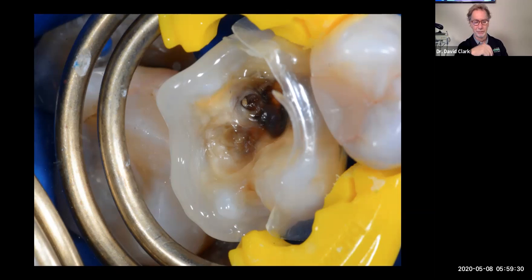I would say more often than not, because as we know, the background fluoridation of these teeth is often so high that many dentists will try to do a sealant, or see a little bit of staining in the grooves and not decide to use caries detector or disclosing solution to open it up. You open just a small occlusal groove and boom, you get these large occlusal caries. With heated and injected composite, if you don't use this, you're going to wind up getting it all over the proximal surfaces. And this is actually much faster. It makes the finishing and polishing very quick, and the results are just beautiful afterwards. This does not take long to do. I would say the majority of the time I'm doing occlusals, I'll do this. And we're going to provide some video examples of it as well.